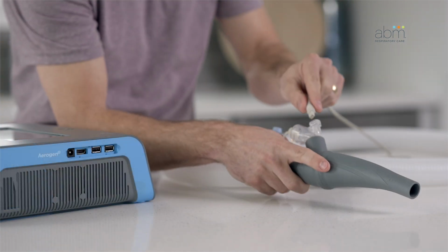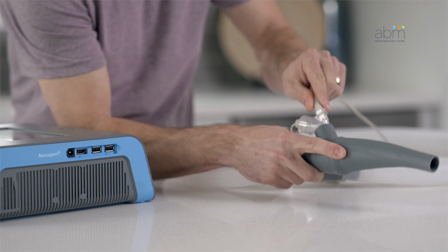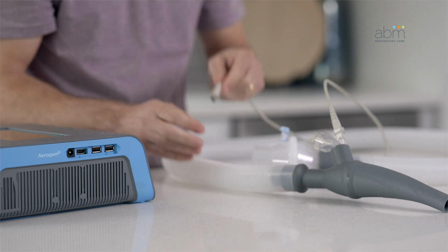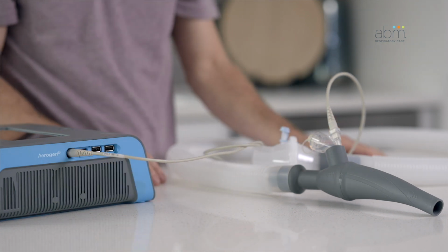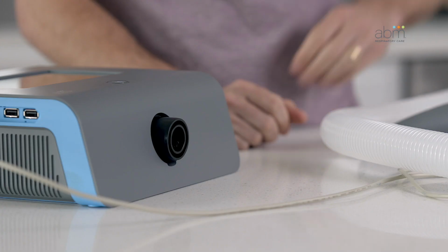Plug the larger end of the nebulizer power cable into the neb cup. Then plug the smaller end of the cable into the side of the device where the Aerogen logo is displayed. You may have to move the rubber cover to access the nebulizer power port.